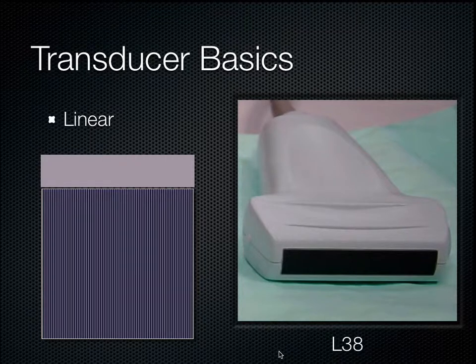Generally speaking, these tend to be higher frequency transducers that are used for the first few centimeters of soft tissue. Anything greater than 5 or 6 centimeters of tissue, you're going to need to switch to another transducer. So this is all the near field stuff. Think about soft tissue cellulitis versus abscess. Think about DVT work, vascular access, all the musculoskeletal functions such as looking at fractures, reducing fractures, joint effusions, tendon ruptures, nerve blocks, those types of procedural guidance, things like that.